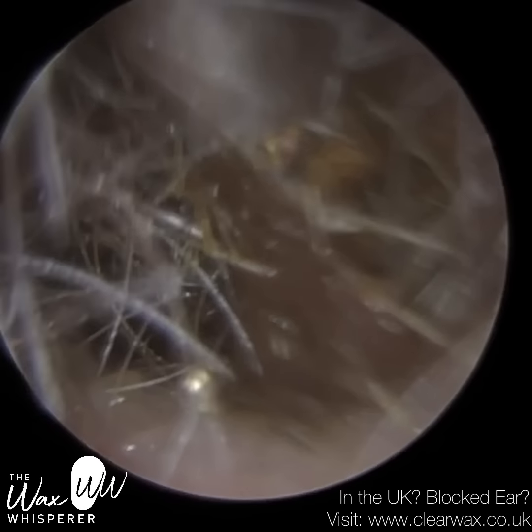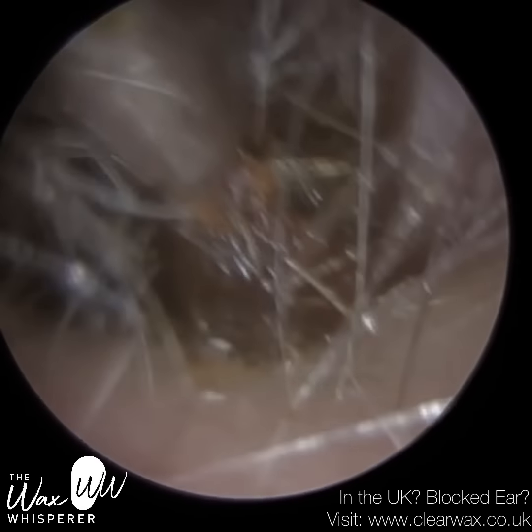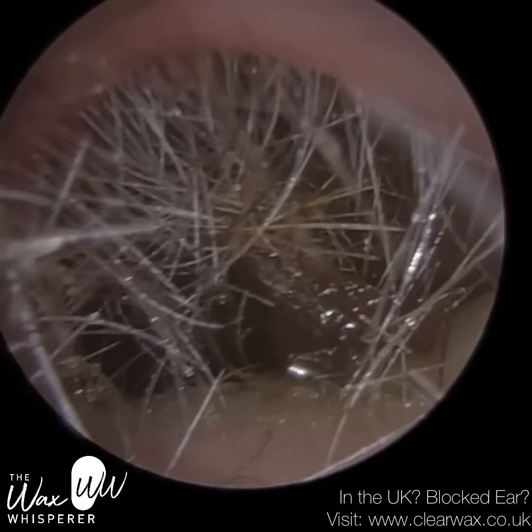In a moment, I am going to use a St. Bart's earhook. I'm going to prise this out at the entrance of the ear canal. But the complex part of the procedure is complete.